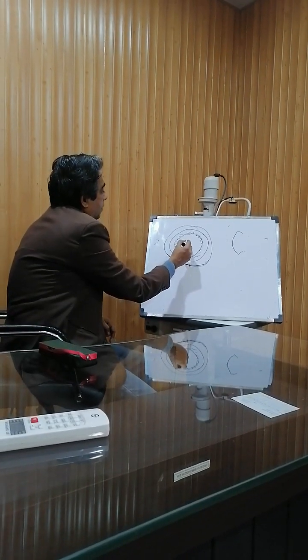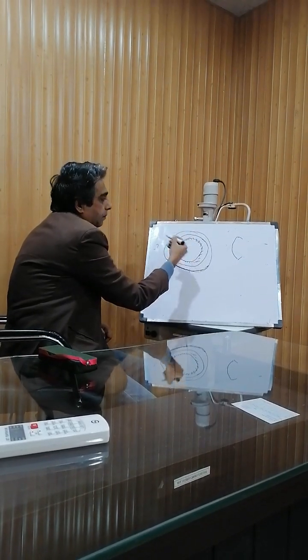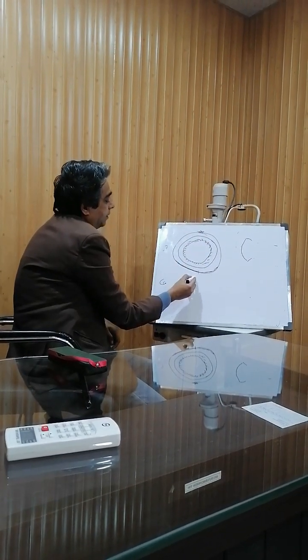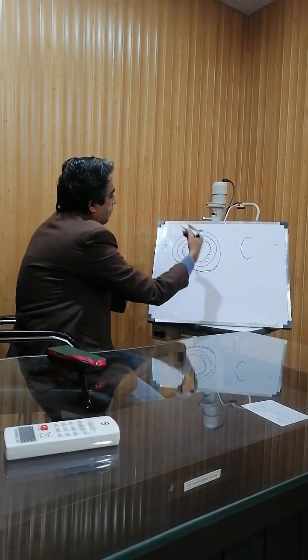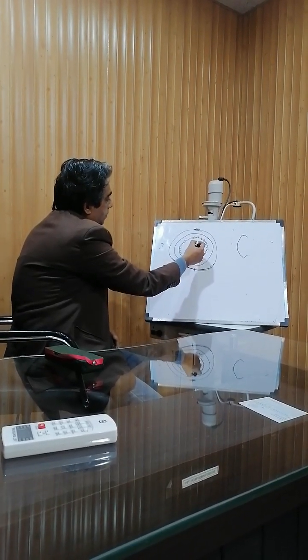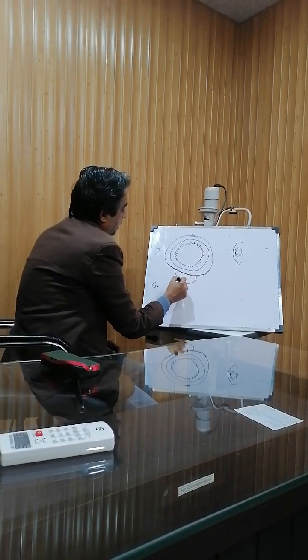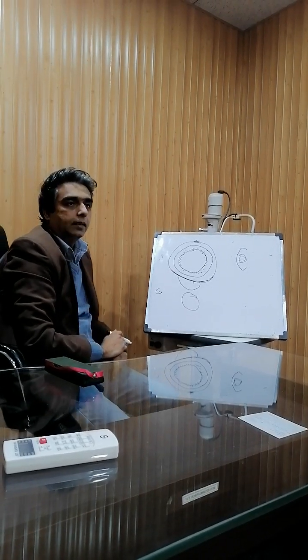Then with the help of two instruments, you put gel into the eye, you put some blunt instrument like a squint hook at the posterior part of the eye or on the sclera, and some other like suture tying forceps at the 12 o'clock, and by alternate pressure you remove the nucleus, this part, slowly from the eye, and here is the nucleus, the cataractous lens.